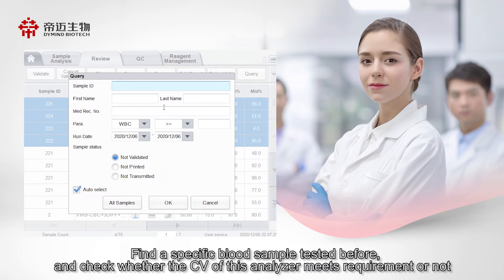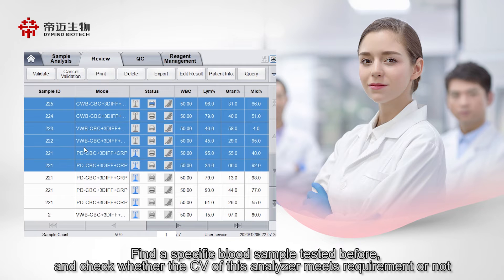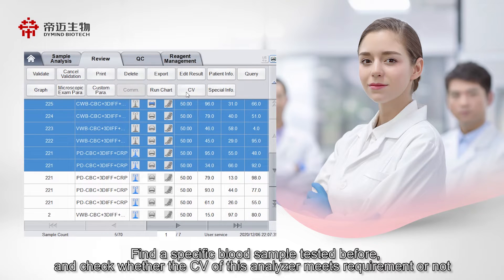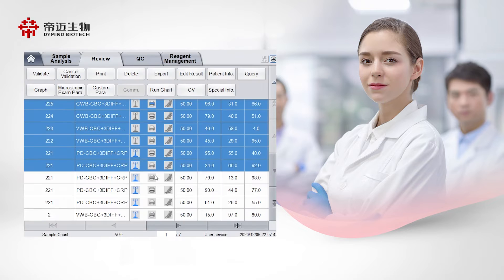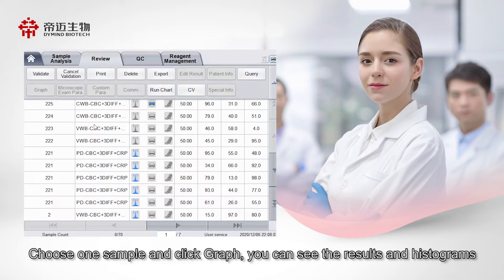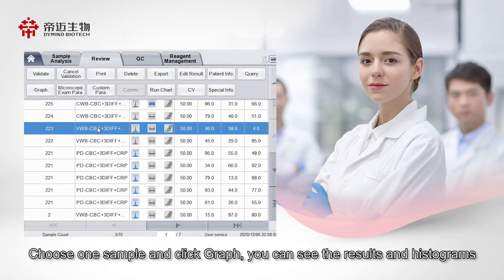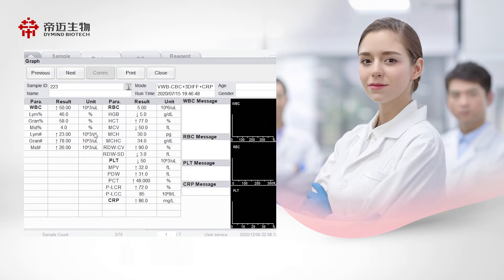Find a specific blood sample tested before and check whether the CV of this analyzer meets requirements. Choose one sample and click Graph to see the results and histograms.